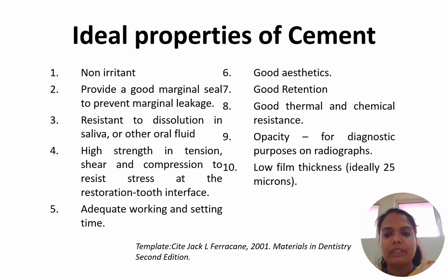Coming to the ideal properties of the cement, first, it is a non-irritant cement, provides good marginal seal to prevent marginal leakage, resistant to dissolution in saliva or other oral fluids, high strength in tension, shear and compression to resist stress at the restoration tooth interface. It provides adequate working and setting time. It also provides good aesthetics, good retention and good thermal and chemical resistance. It provides good opacity for diagnostic purposes on radiograph. And finally, it has low film thickness, ideally of 25 microns.